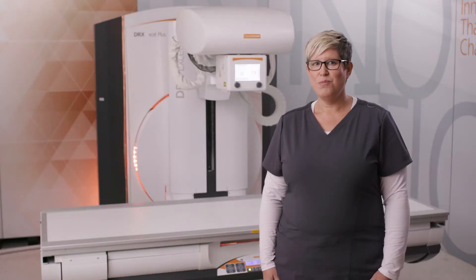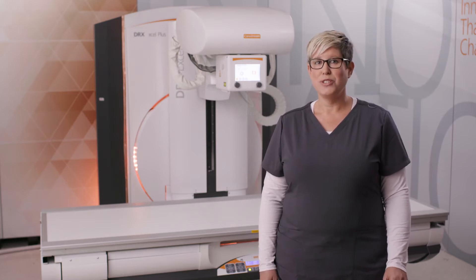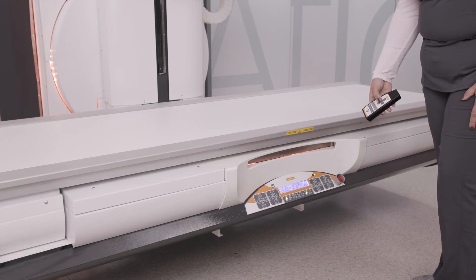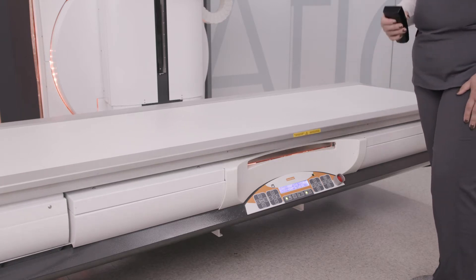The XL Plus table has built-in anti-collision sensors to ensure patient safety when positioning remotely. Its four-way float table movement provides a full patient coverage of 201 centimeters, allowing effortless positioning of even the tallest individuals.